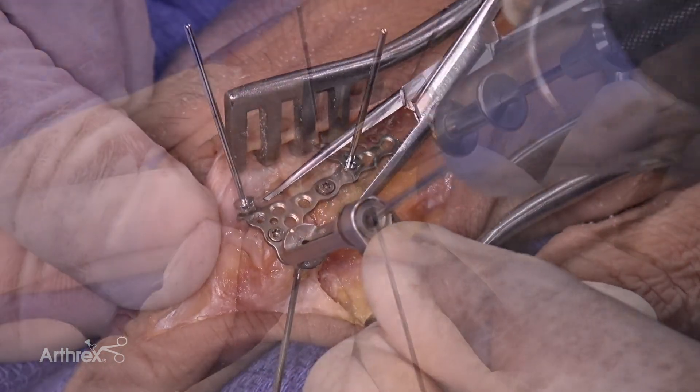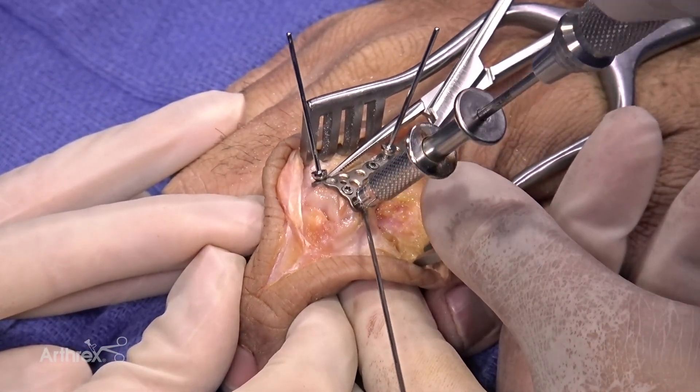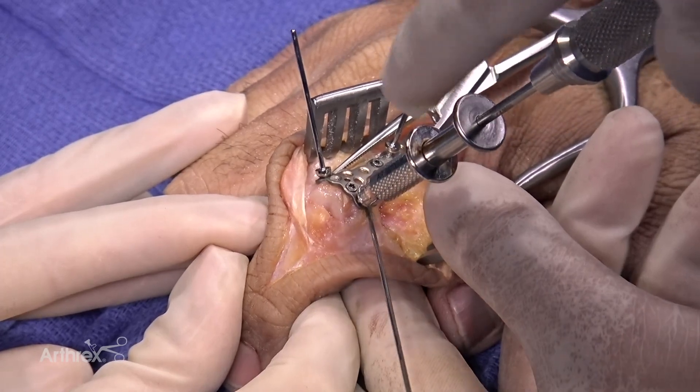We'll repeat this process — drill, measure, and put the appropriate size screw in — until you feel you've had enough fixation for your fracture pattern.